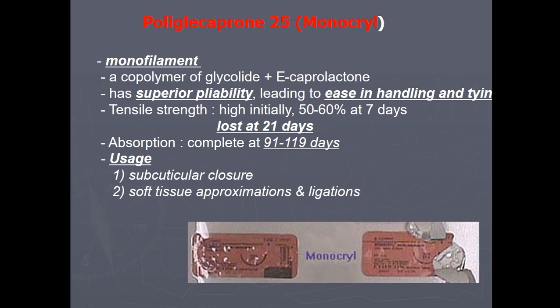Usage: subcuticular suture, soft tissue approximation, and ligation.